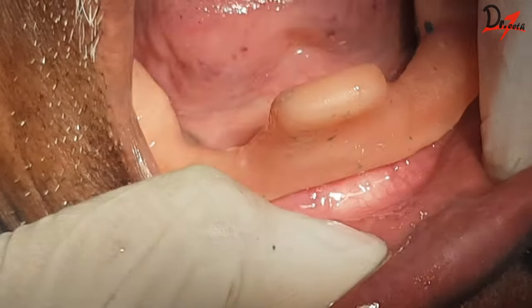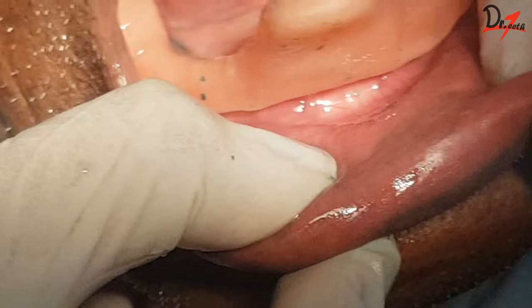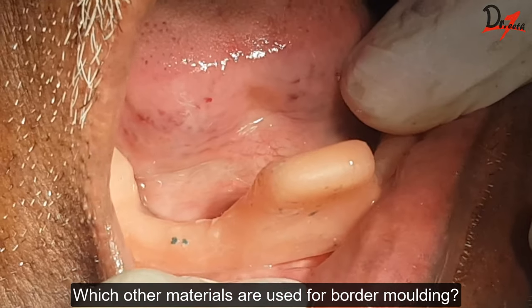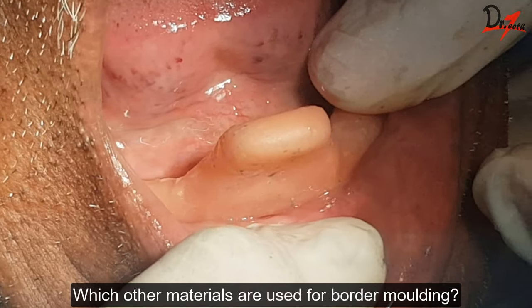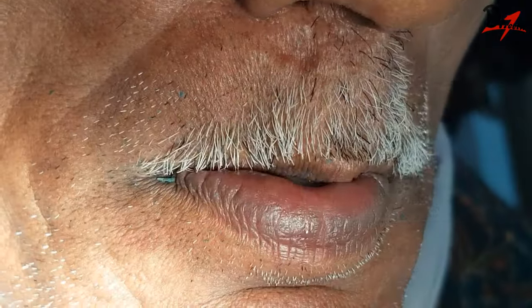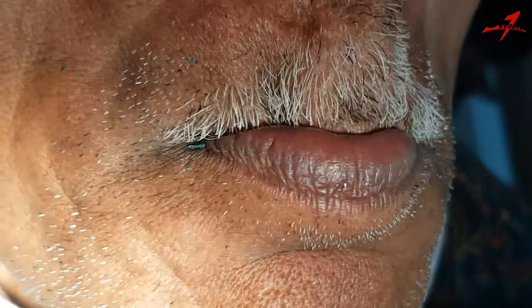We begin by checking our special tray in the patient's mouth. It is very important that the tray is at least two millimeters short so that we have enough space for the material — in this case, the material is green stick. Also, don't shorten it too much because the green stick can fracture from those areas. Check the extension of your tray by placing it in the patient's mouth and asking the patient to do all kinds of movements.